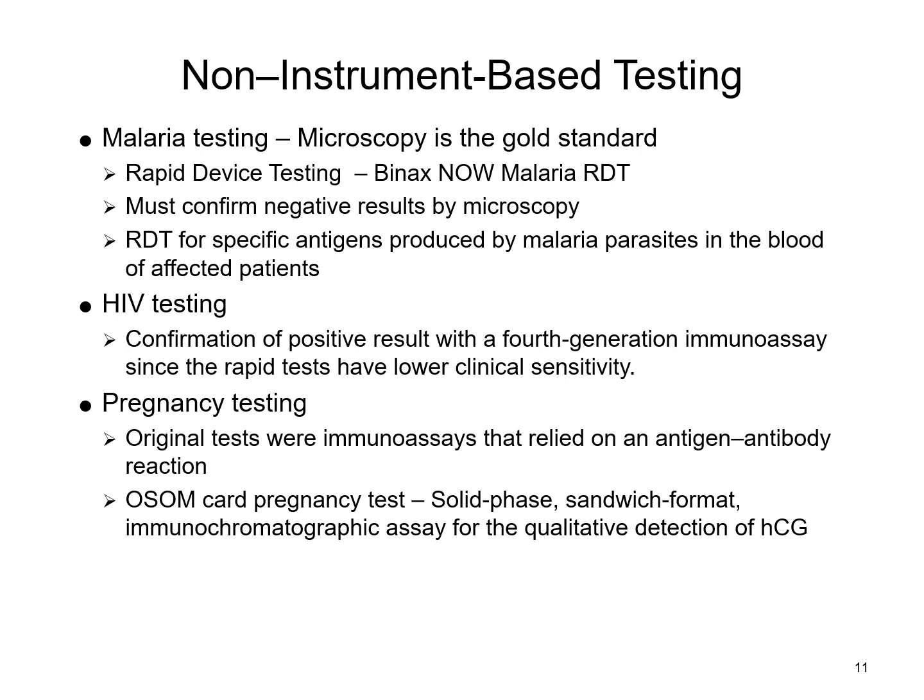We're going to talk about just a couple of these tests that are available for rapid testing. You may be familiar with some of these. I'm not expecting you to know a lot of detail about them. Just be familiar a little bit with the principle of it.